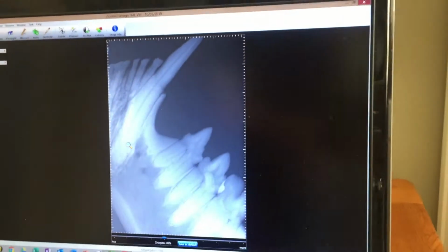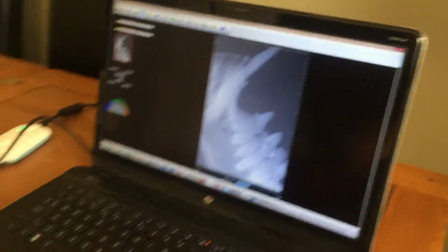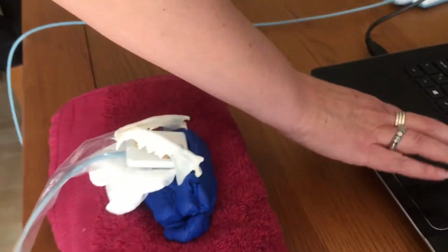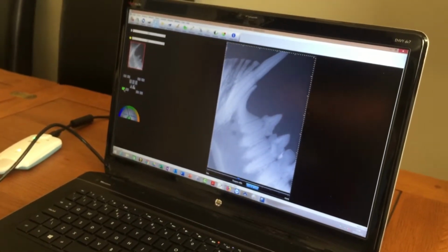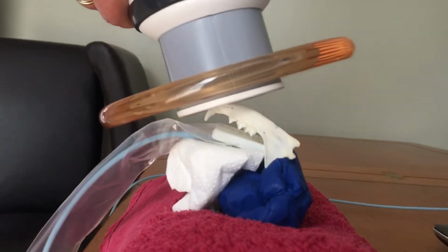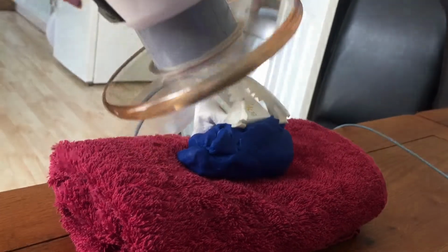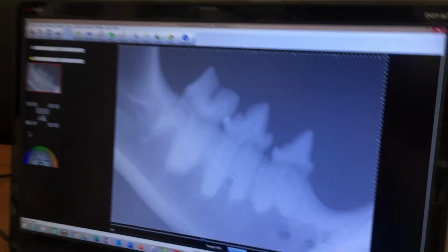Now the question was how to get back far enough to take the last molar. So we can do that in one of two ways. We can either push the sensor further back in the mouth, so it's just literally going back further in the mouth. And I'll just get the right box up here. So again, we go back to the start position, which was about 70 degrees. Now we're just going to come over here, probably more in the end, about like 45 degrees maybe, and just further back in the mouth. And there we are, so we caught the last molar.